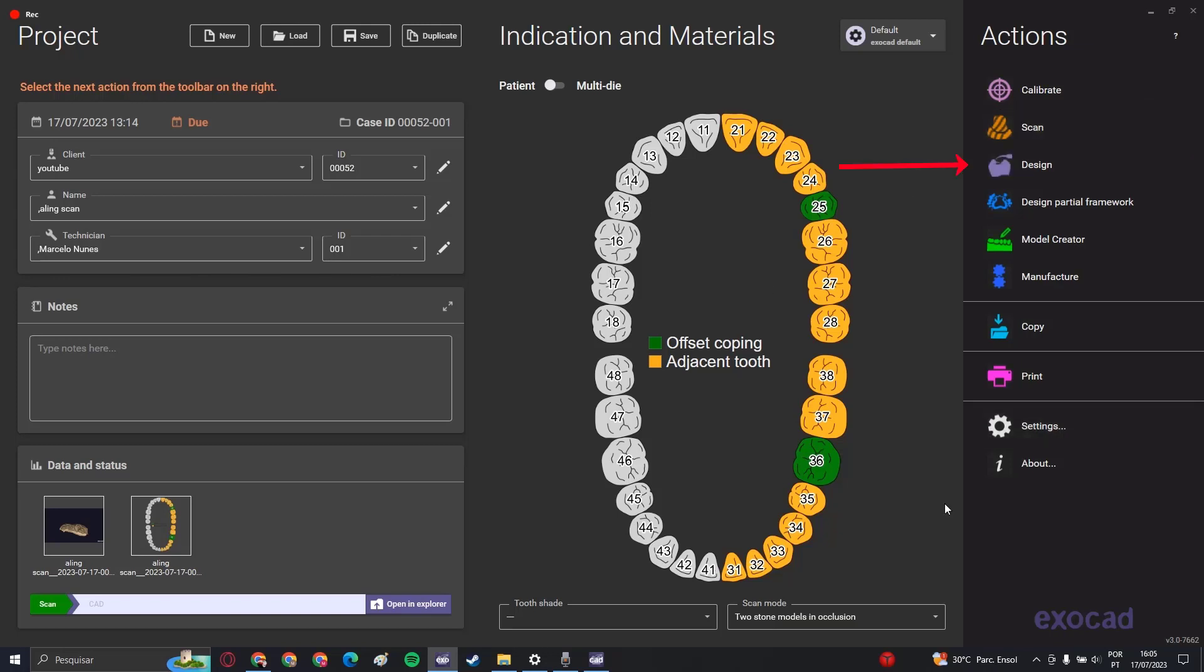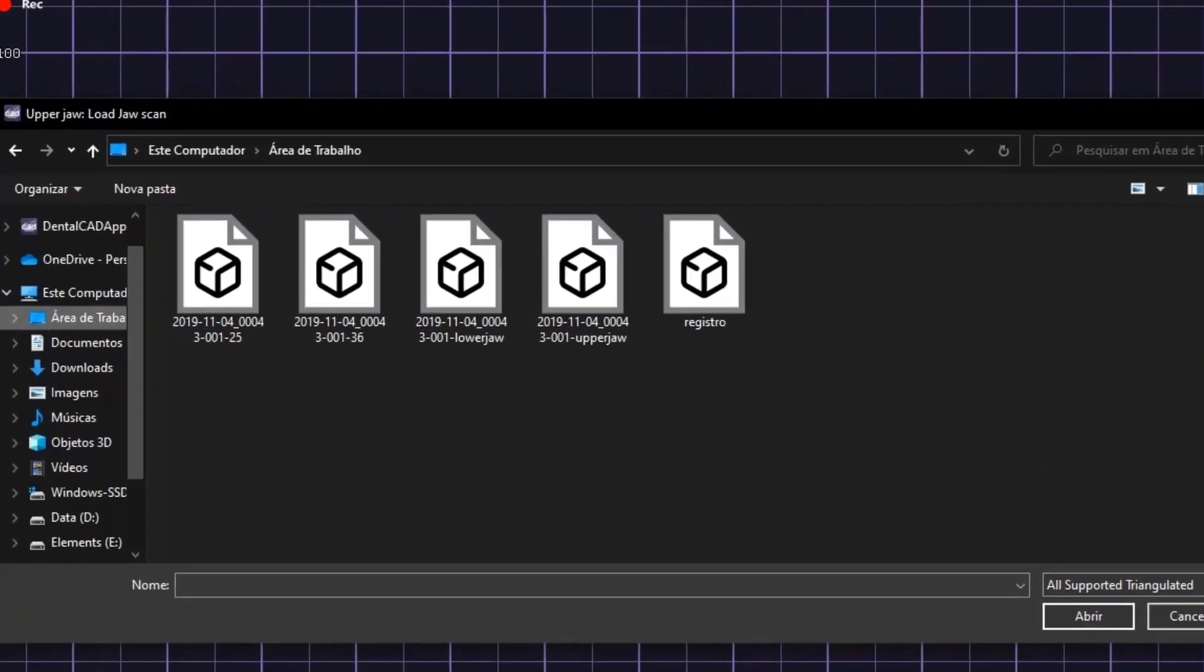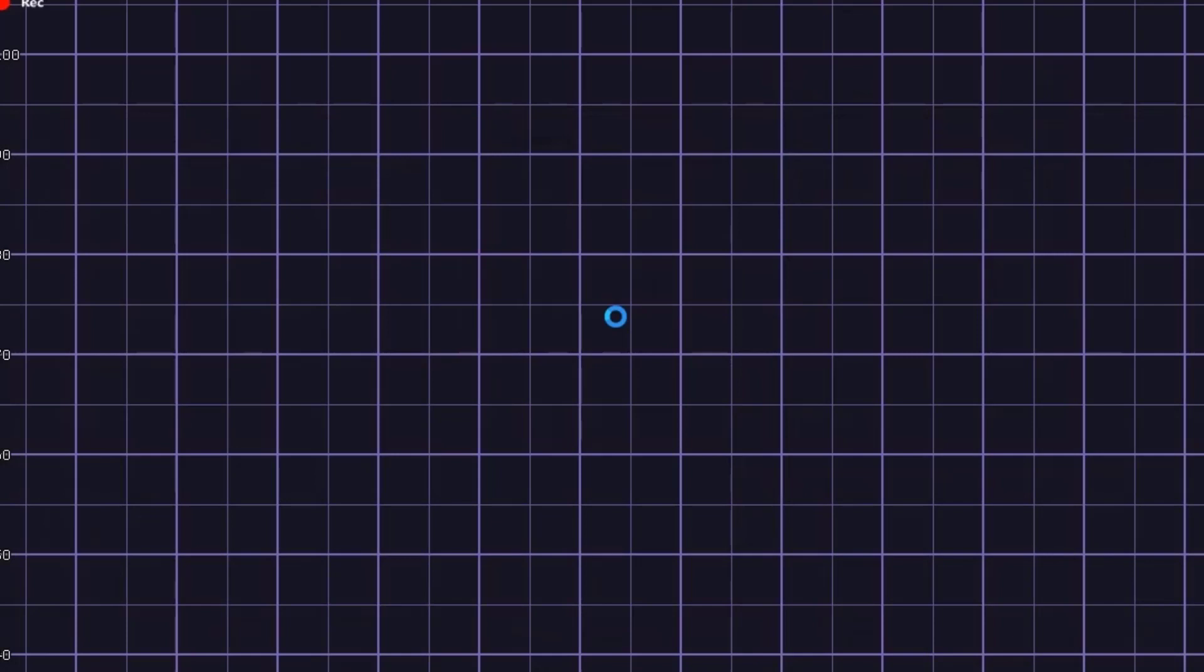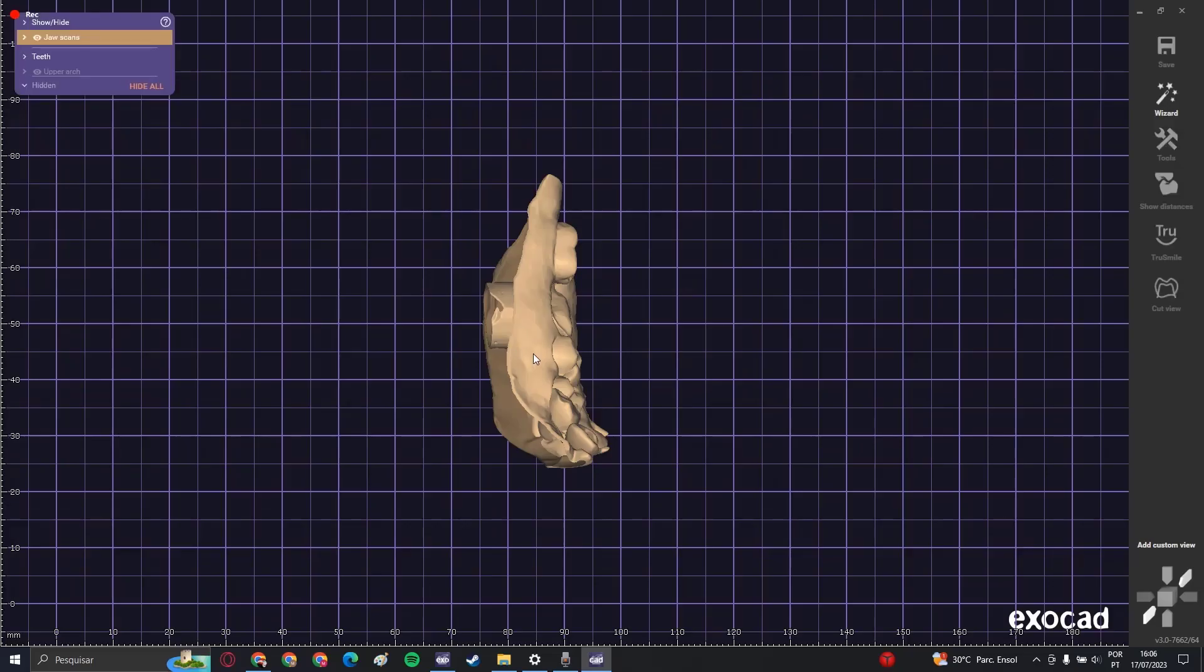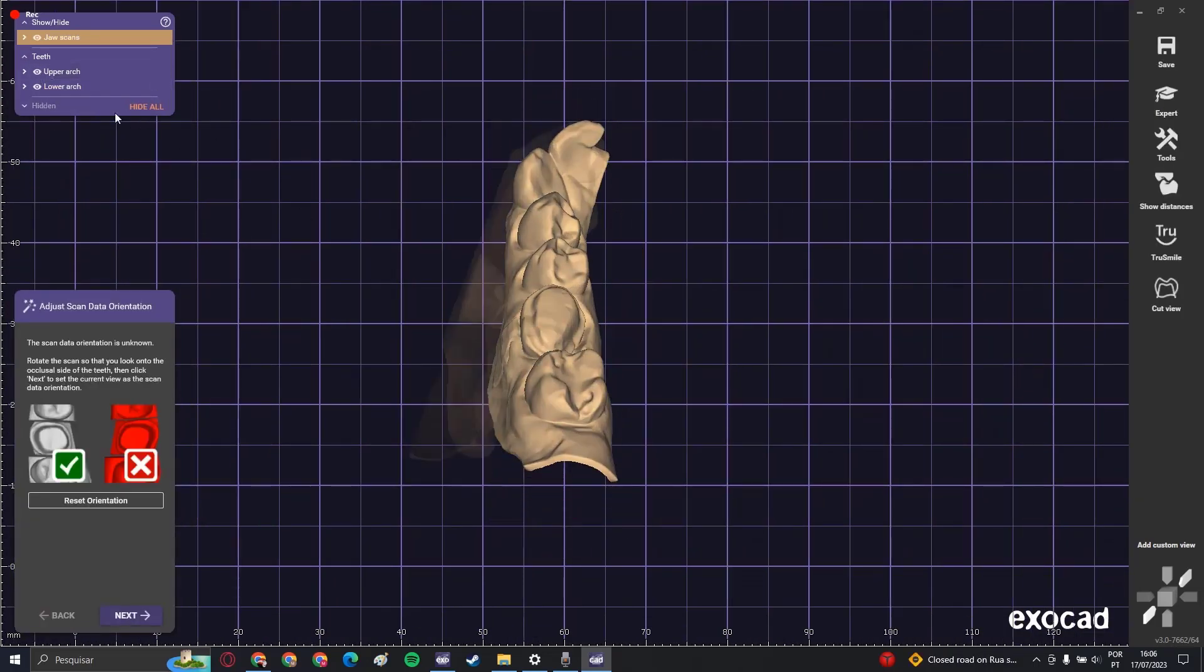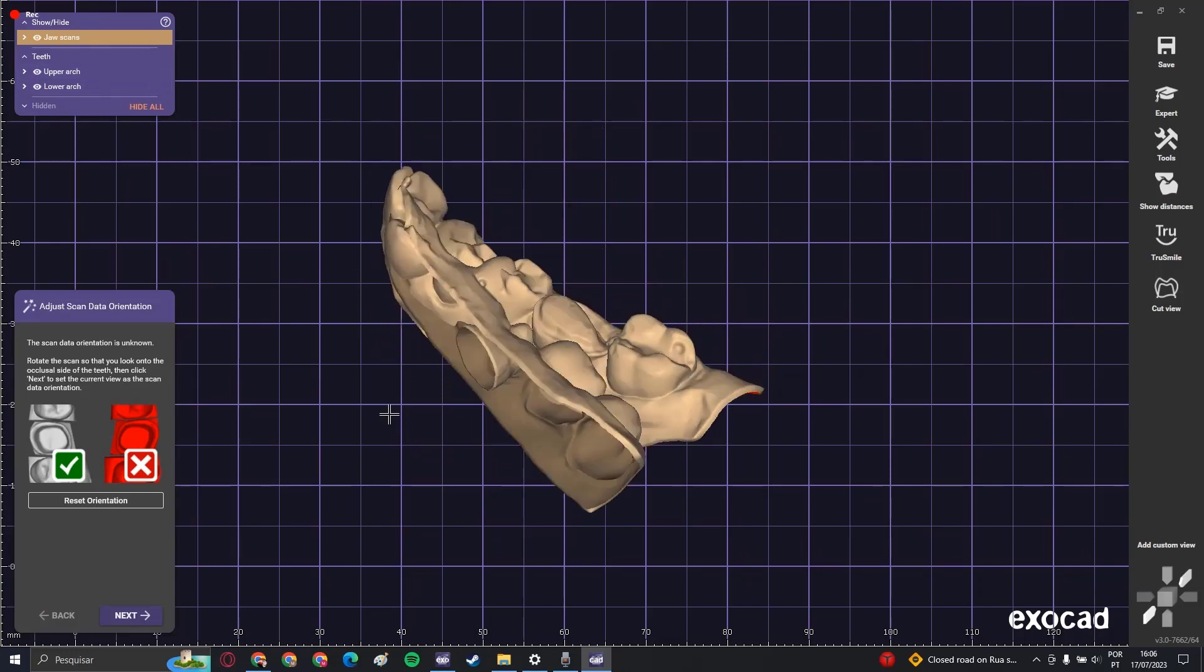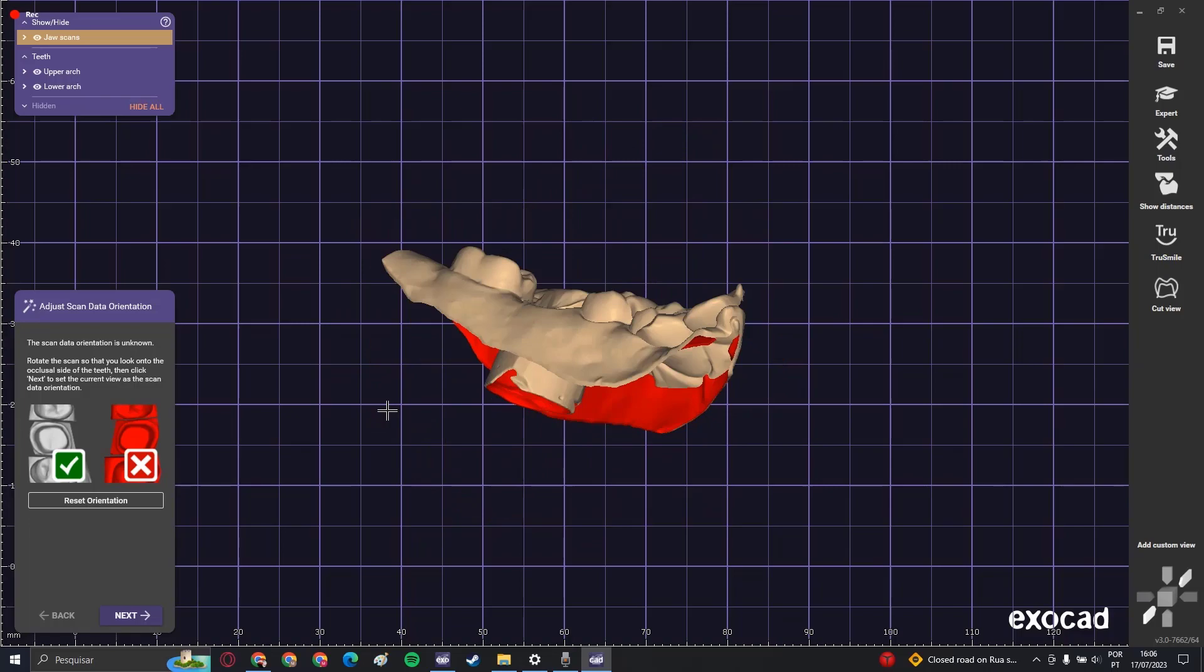Hit design to open up Exocad. The first thing you'll notice when you open the design page is the upper left corner. Exocad will tell you which scan you have to open first. Double click on upper jaw to open the upper jaw scan, then lower jaw. As you can see, they are not in the right position.